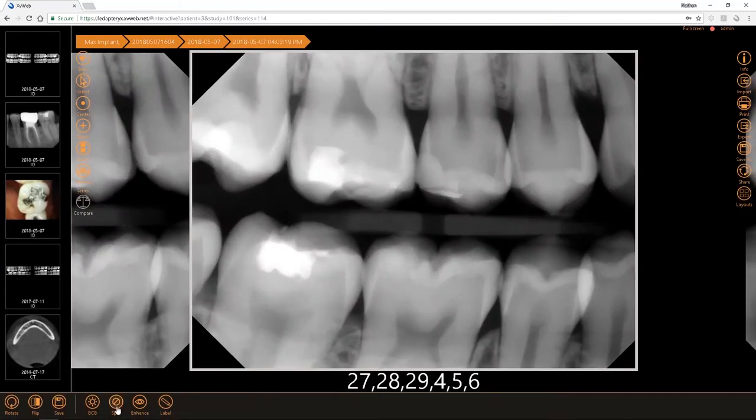From there you'll have a toolbar at the bottom that will pop up. This gives you the ability to rotate images, and flip images horizontally or vertically.